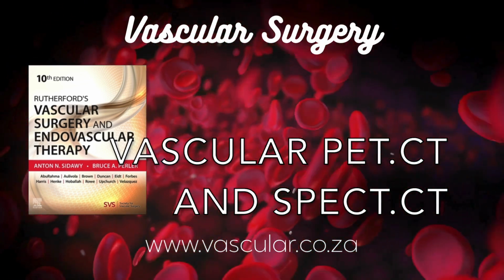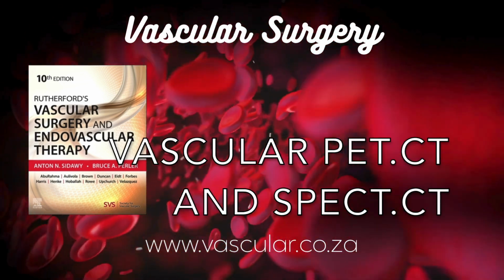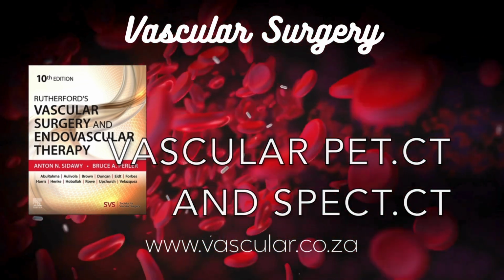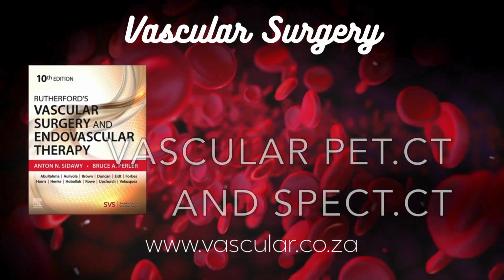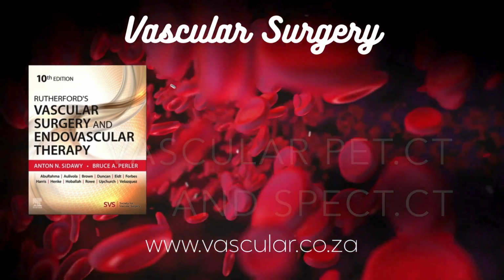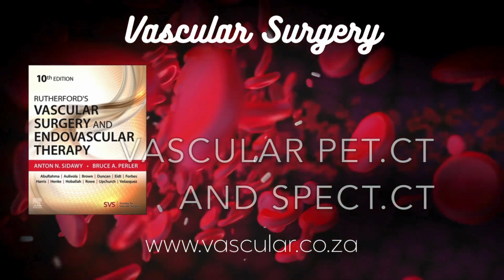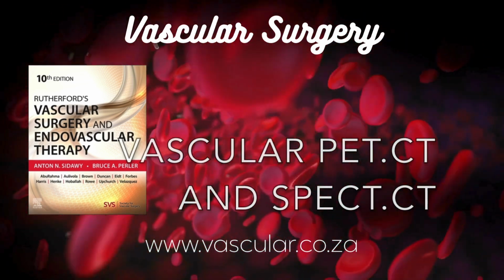Definitely. Especially when patients have vague symptoms, like fever of unknown origin, weight loss, just feeling unwell. FDG-PET can often pinpoint the vasculitis when other tests are inconclusive. How accurate is it? Studies show high sensitivity and specificity, especially in patients who haven't started treatment yet and have high inflammatory markers in their blood. It's quite sensitive in biopsy-proven GCA too. We see typical patterns. GCA often affects the aorta, subclavian arteries, TA affects the aorta and its main branches.